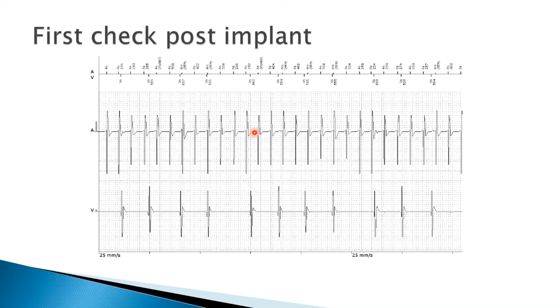This patient is having an atrial tachycardia coming back again. And this is very constant with variable block. So it means the AV node is not very great to begin with. That is why whenever you have an atrial tachyarrhythmia going on, it doesn't conduct down constantly one-to-one, which is actually good in a way for this patient, because imagine if you have an atrial tachycardia that goes at almost a rate of 200 beats per minute conducting down, the patient may get very bad symptoms.